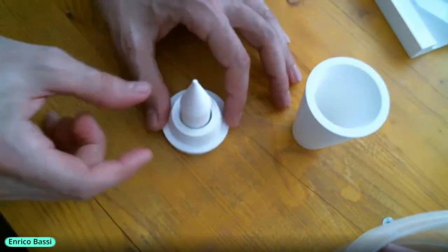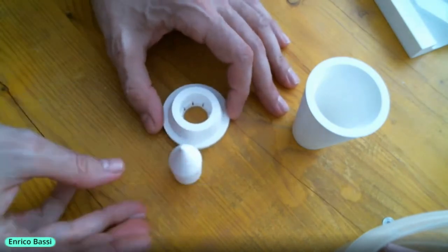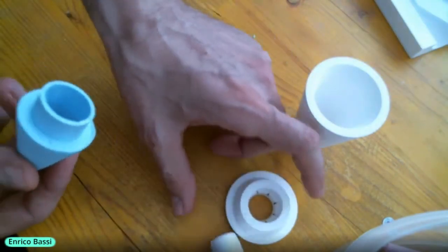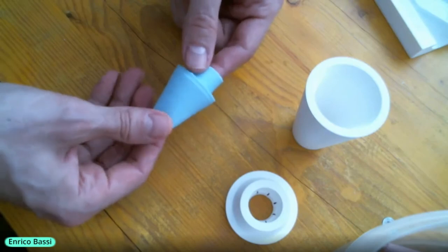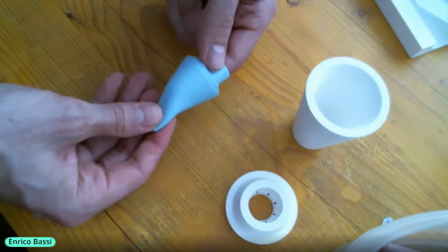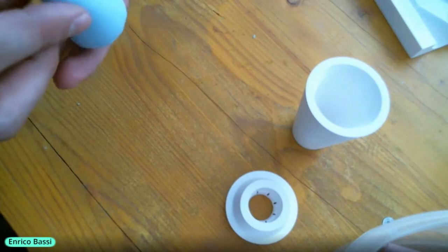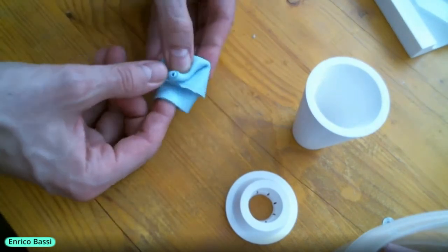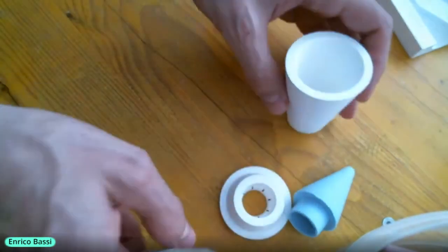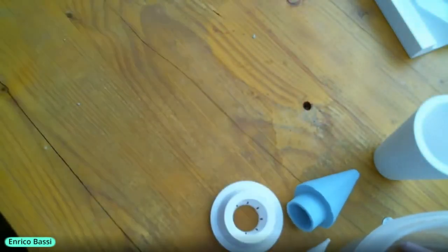It's divided into three parts, because this, being very narrow, could rip if the two objects would be just one single one. But in this case, it's easier to remove one than the other. This is actually the object. A guy that should have been here today is Alessandro Terrani, a doctor, a healthcare professional. He had some troubles, so he couldn't participate, but we developed together one of his ideas, a brilliant idea to support people during tracheostomy, and this was an experimental part that needs to be solved. It is very hard to 3D print. He tried, but the results were not the best, so this could be an alternative, and it's a good way to get flexible parts. Of course, when you get rigid molds like this, you have to be very careful on how to demold the object, but that's, of course, another thing.